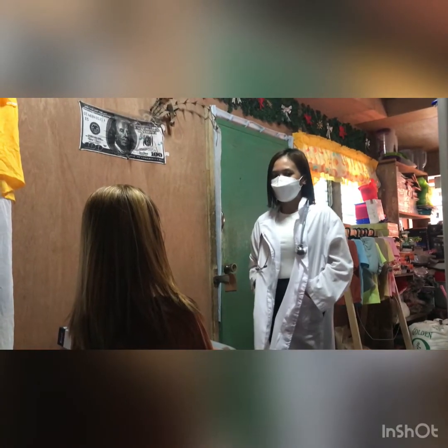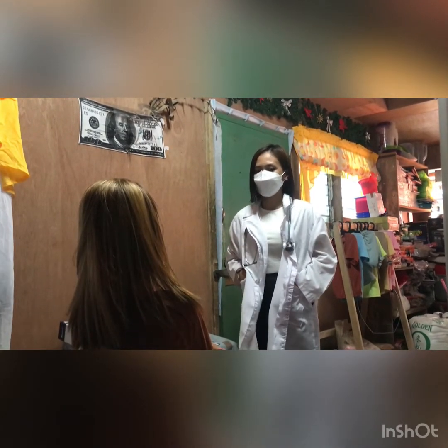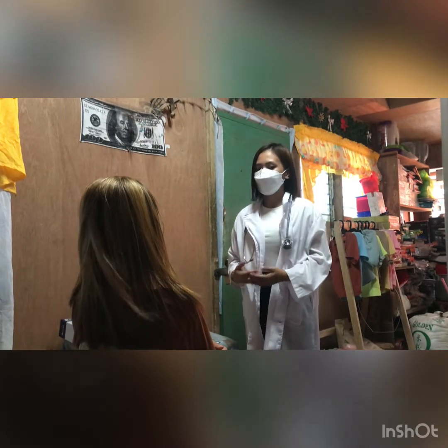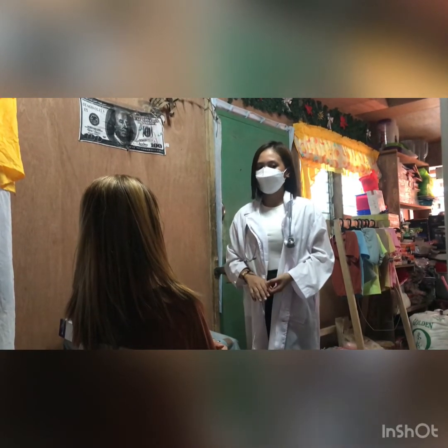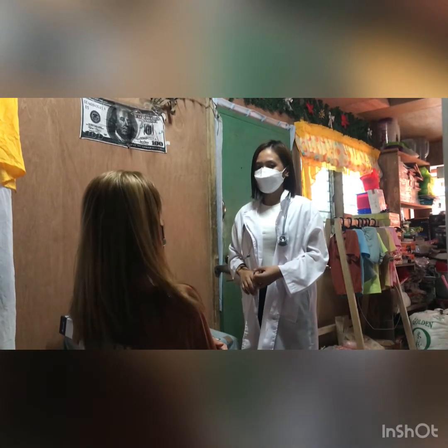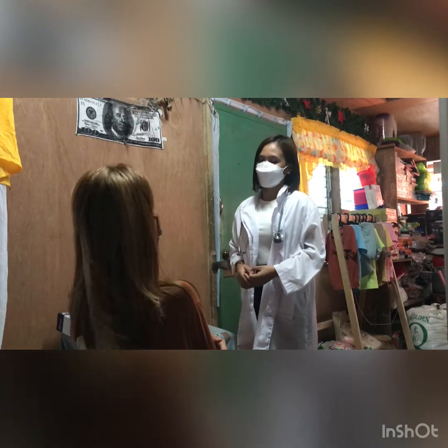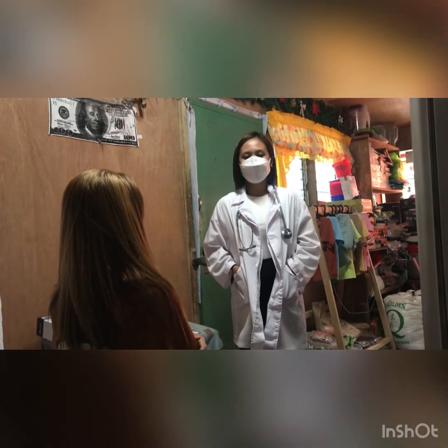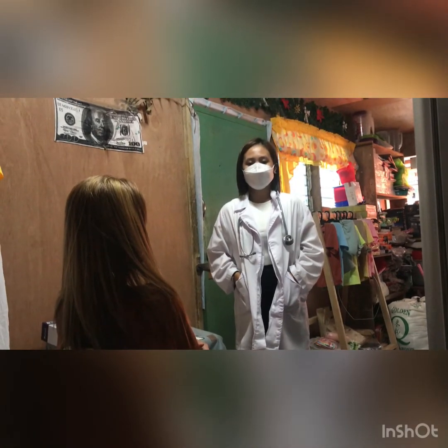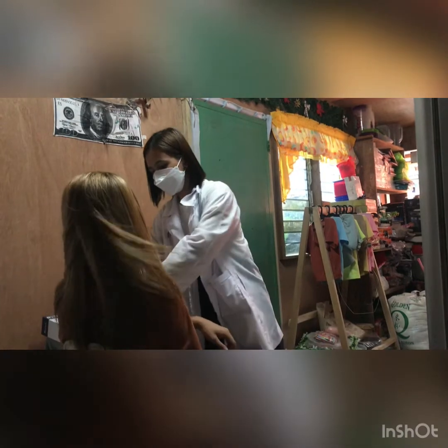For today, I will be checking your vital signs, which is important for us to know if there is any problem with your health condition. The vital signs consist of 4 elements, which are the body temperature, pulse rate, respiration rate, and blood pressure. Expose the patient's axilla by securely folding the client's shirt sleeves or gown up to the deltoid region. So, ma'am, can I fold your sleeves?